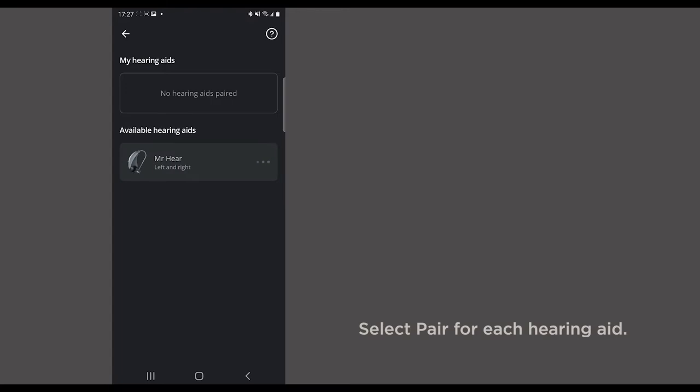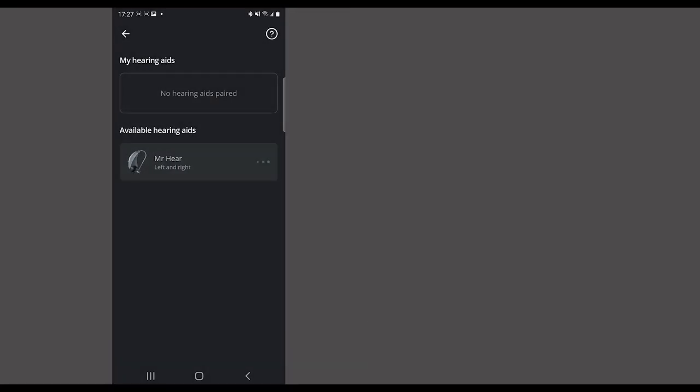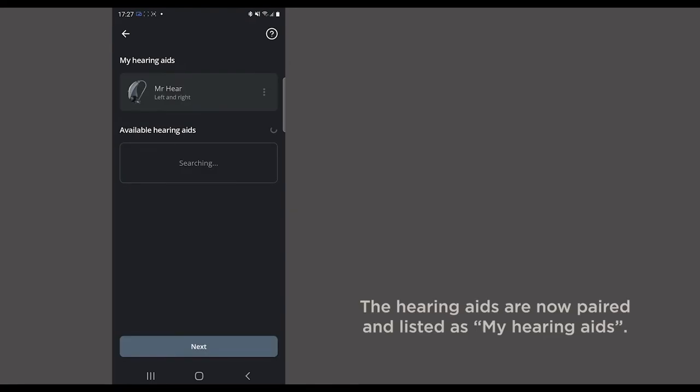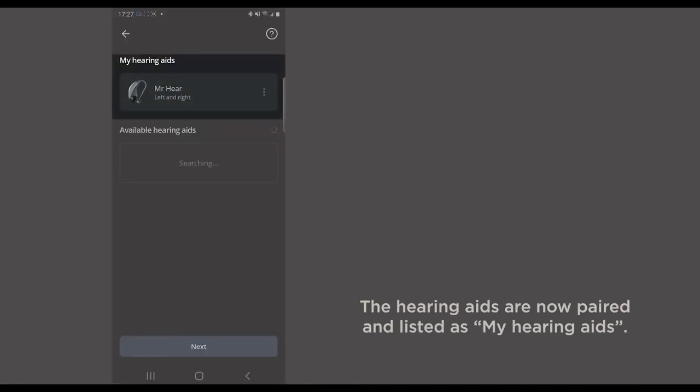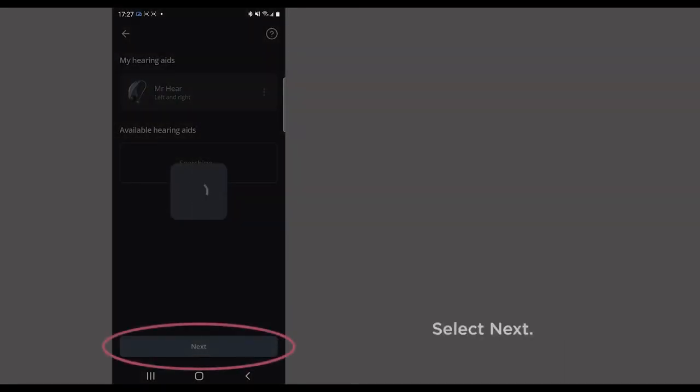Select Pair for each hearing aid. The hearing aids are now paired and listed as My Hearing Aids. Select Next.